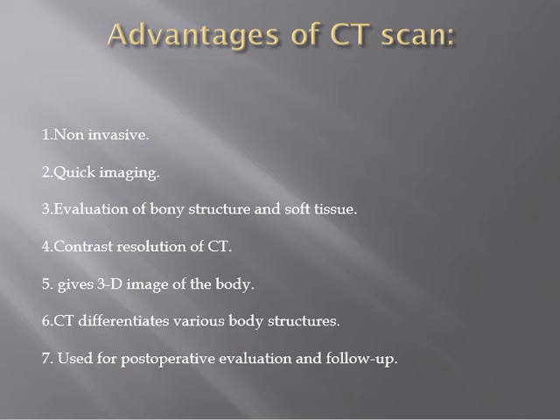Advantages of CT scan: non-invasive, quick imaging, scan time less than 1 minute, so reduced patient motion artifact. Evaluation of bony structure and soft tissue. Contrast resolution of CT is much better than conventional X-ray. Gives three-dimensional image of the body, so it gives the exact size of the lesion and its relation to adjacent normal structure. CT differentiates various body structures from each other and demonstrates their relationship. No superimposition. Used for post-operative evaluation and follow-up.